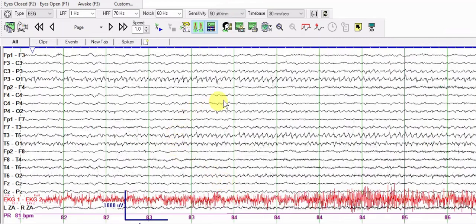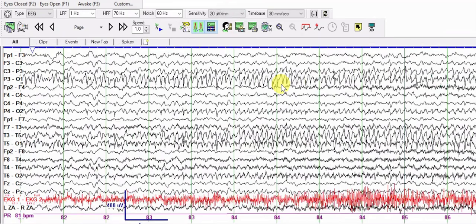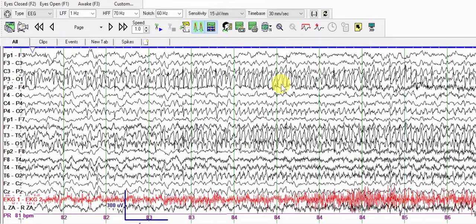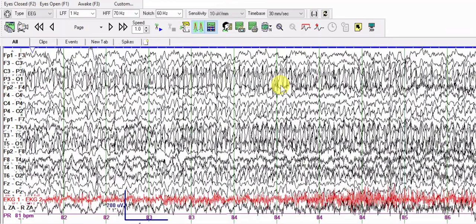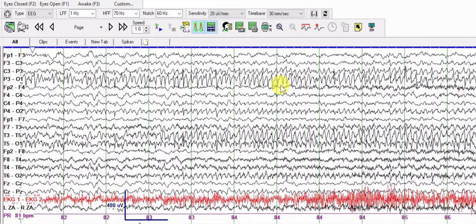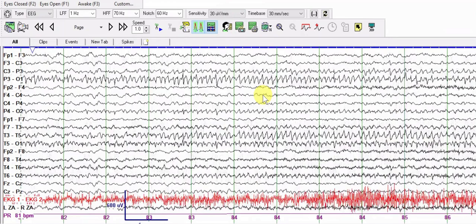At 50 microvolts per millimeter this just looks like an asymmetric background, but at 7 microvolts per millimeter you realize it is a seizure. Even at 10, 15, and 20 microvolts per millimeter it is quite prominent and quite impressive.